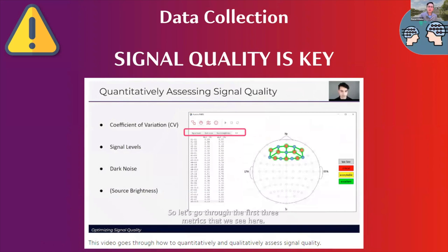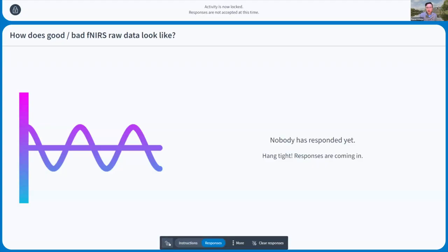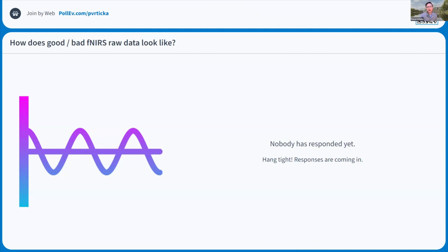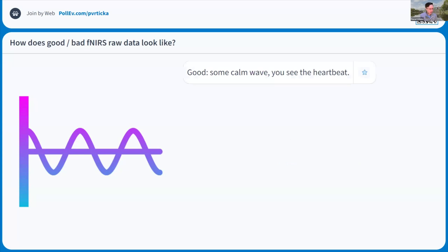But maybe you don't just want to look at those generic indications of excellent, acceptable, critical, or too low signal levels — you want to actually look at more detailed properties of the raw signal. So imagine you are setting up your study and want to make sure data is good enough before starting the recording. A question for you: how does good or bad fNIRS raw data actually look? What should you be looking out for when you do a raw signal data quality check?